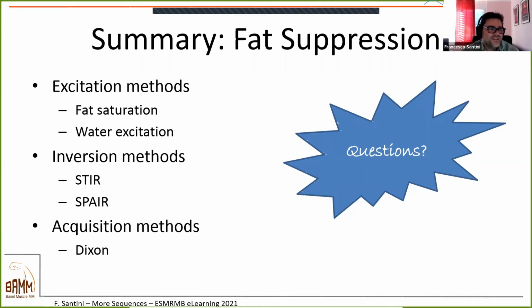Yeah, so you definitely use T2 weighted sequence, usually turbo spin echo based. I think that the fat suppression method depends on your vendor, what they have better implemented. We sometimes use SPAIR, but it's not super used. STIR is very robust, but also FATSAT can be used, or water excitation. Really, anything. It depends how your sequence is set up and what gives you the best results.